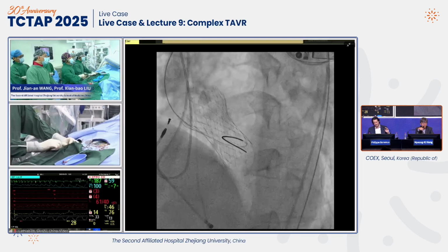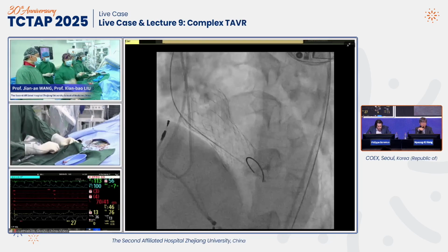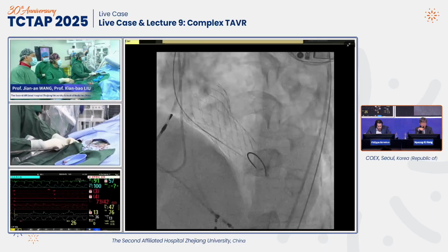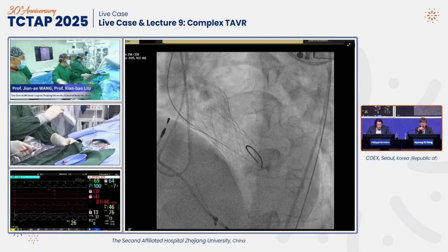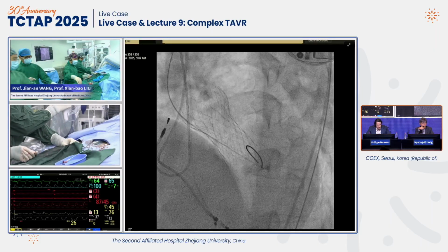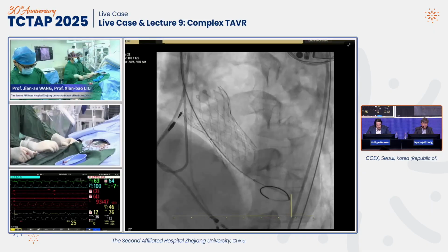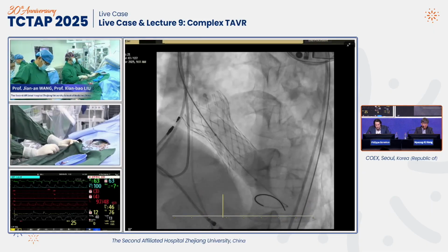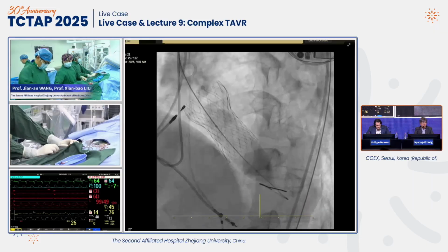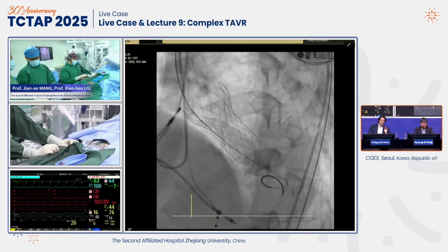Okay. Take a tail, please. Once again, the post dilation is dramatically increased. It's educational for the audience to show how much it expands in real time. Expansion is high, but there is some degree of recollapse.